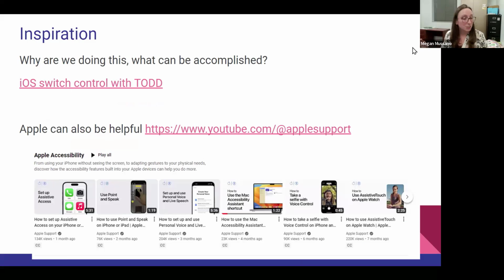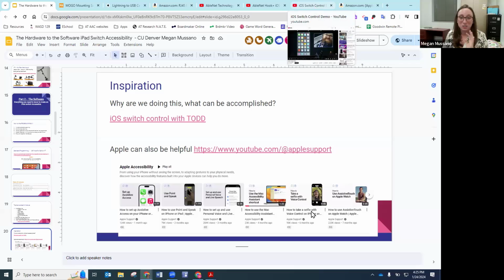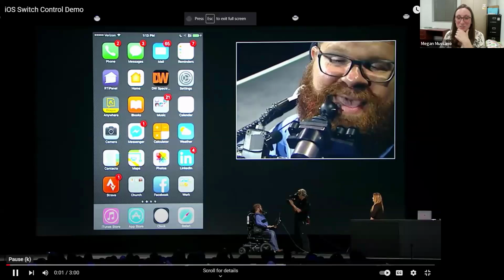Okay, and again, if you have a student who can handle everything and is capable, that's awesome. Here is a little video for inspiration. So just watch this for a second, because this is what it can do in its fullest potential.